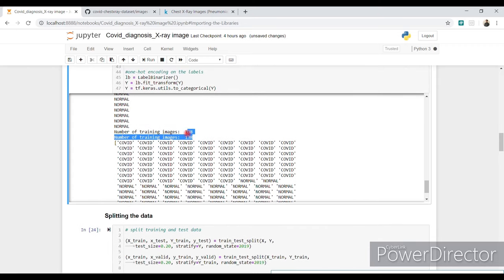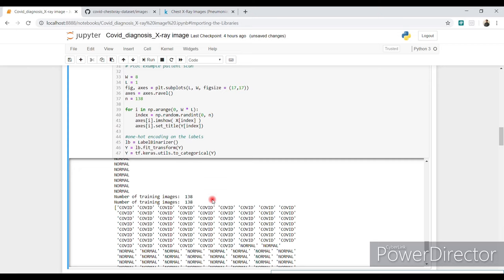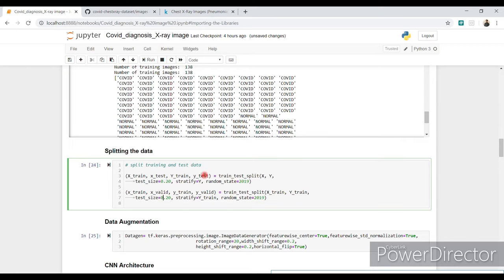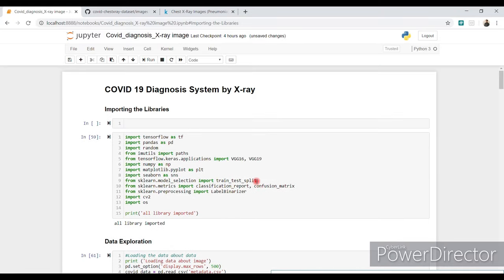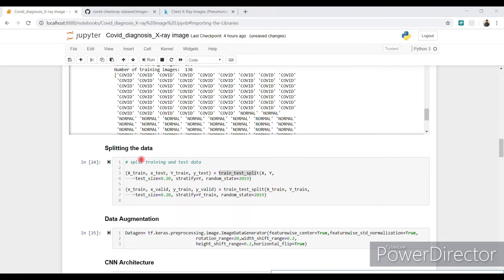The total is 138 images per class — 138 COVID-19 and 138 normal. Make sure your X and Y variables are always of the same length. Then we split the data into X_train, Y_train, X_test, Y_test, and further split the training data into training and validation sets using 'train_test_split' from scikit-learn. After splitting, we proceed to data augmentation.